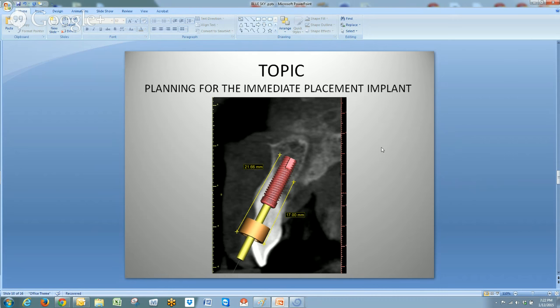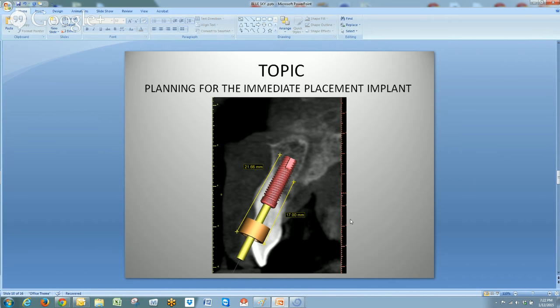Now we'll talk about planning for the immediate implant placement. This is a pretty tricky topic depending upon the drilling system you have. In this particular case, this tooth is going to be removed — it's one of the centrals — and an implant is going to be placed in its spot. We try to keep the implant in a crestal position, and try to get the implant in a position where we will gain some primary stability, which this case provides.